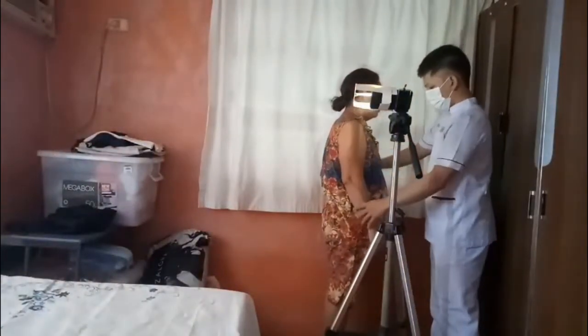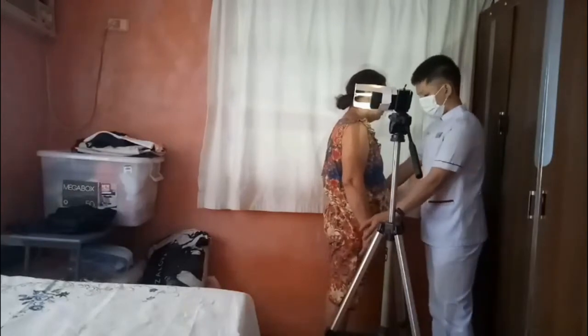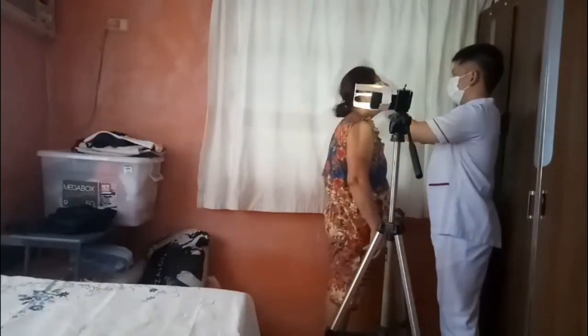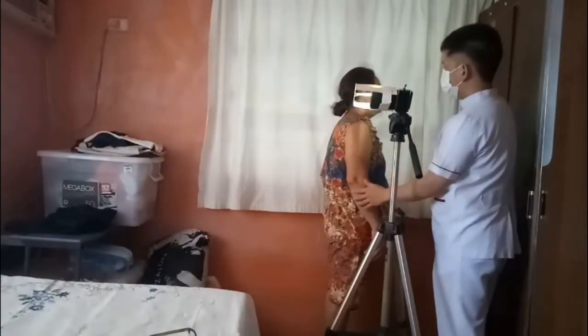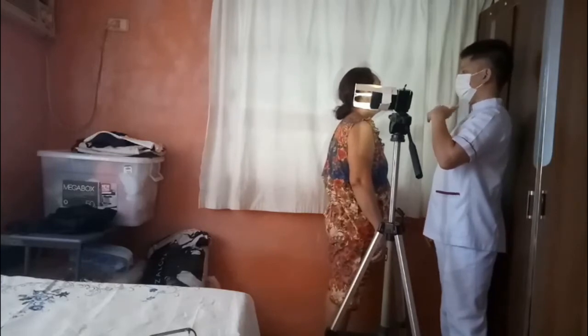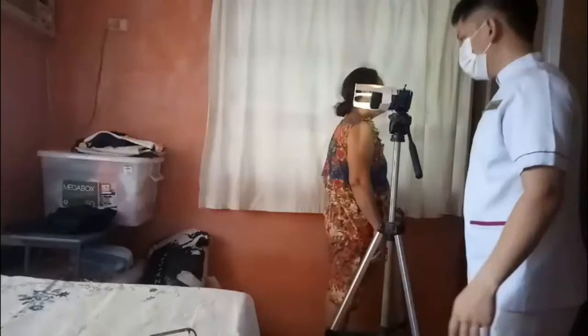Position of the patient. Place the patient in a true lateral position, either seated or standing, before a vertical grid device. Have the patient sit or stand as straight as possible and adjust the height of the IR so that it is centered at the level of C4.